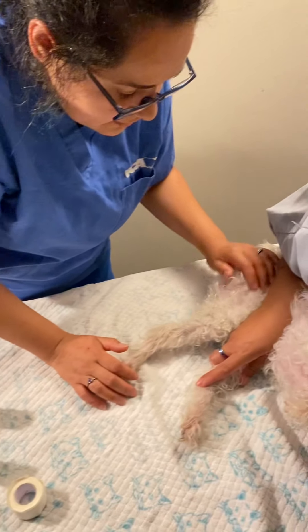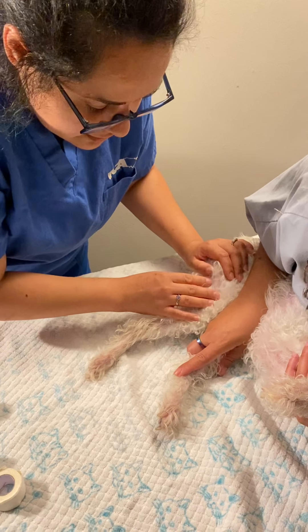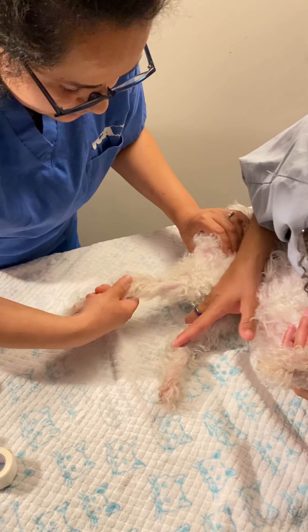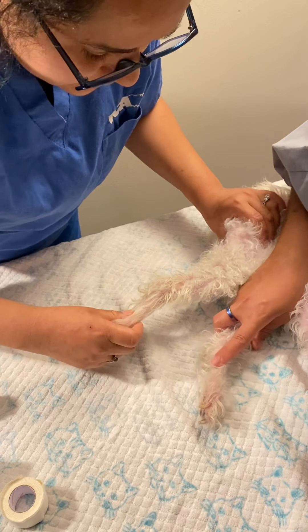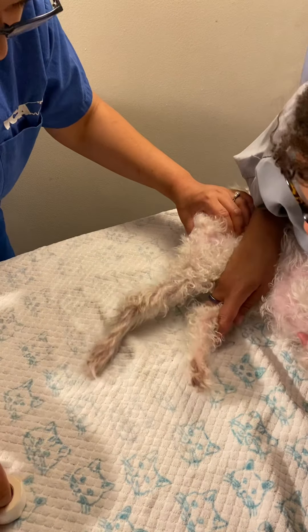This is a modified Robert Jones bandage. Our patient is a canine on lateral recumbency. We're going to do her right hind leg — she's pretty small. We're going to start with the stirrups.